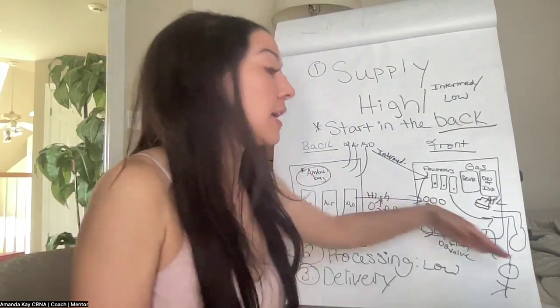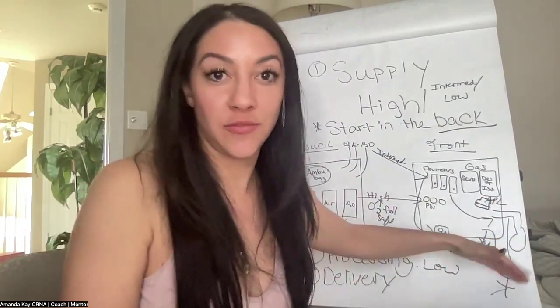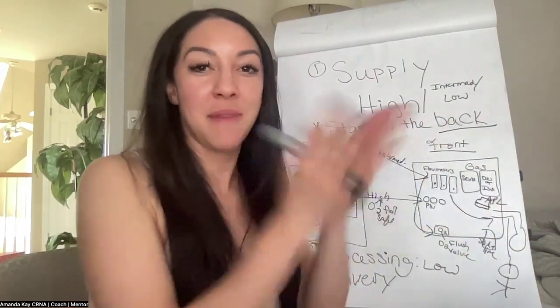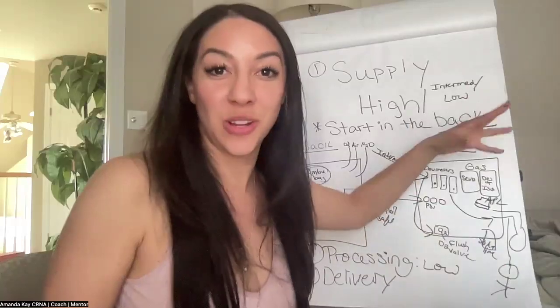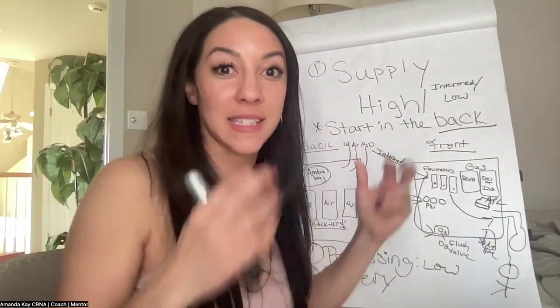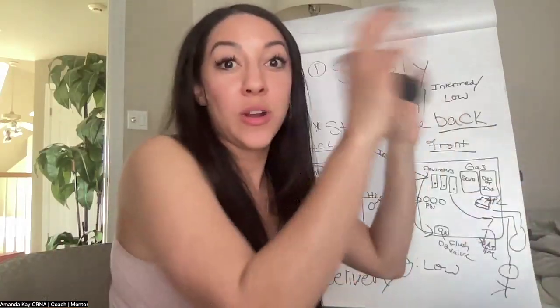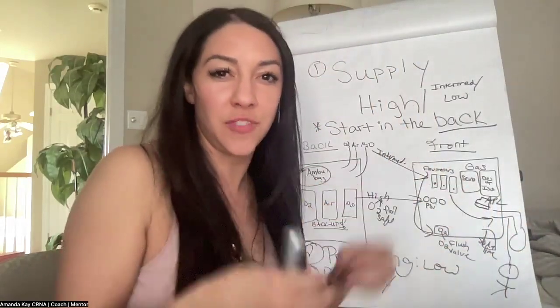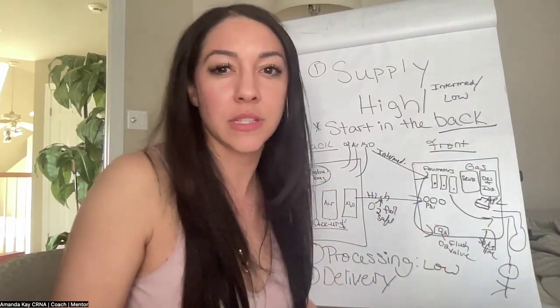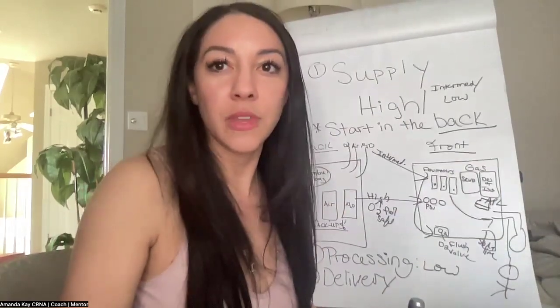That's happened before. PEEP valve malfunction, anything like that. So always, again, like anything else, look at your patient first. I ask that in my mock interviews all the time. High pressure alarm, your vented patient, what do you do? And go, right? Look at your patient. What are they satting? What is their color? Are they biting? And look over the drapes. What is happening over the drapes? And then kind of trace it back. Okay. And then you always want to get a feel of bagging them to see if there's something else going on.